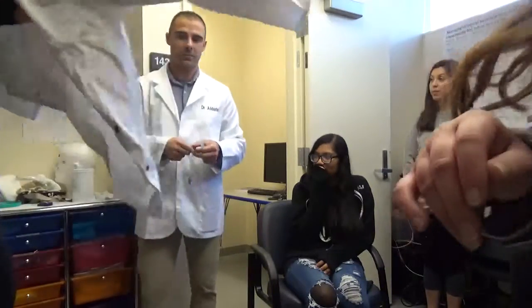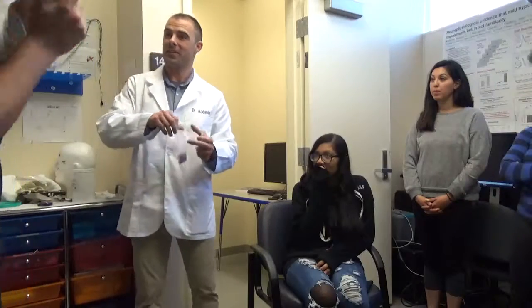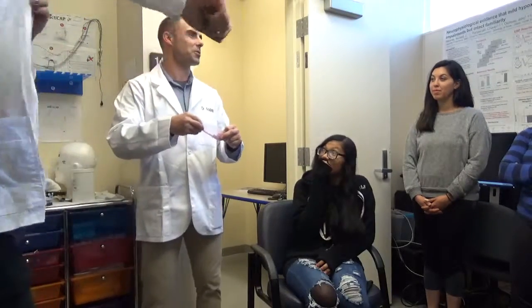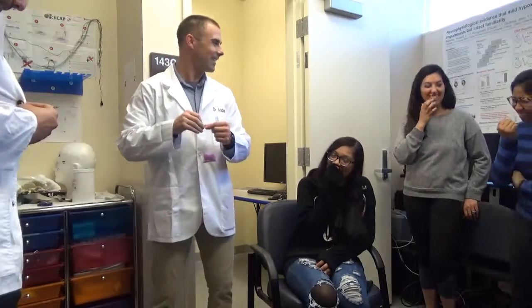So the idea. All right. Remember your name? Jose. Okay, Jose. I feel like we're doing like a street magic show or something. I'm like getting participants off the, so come on down, Jose. Price is right. Right? Yeah. So where are you from now?